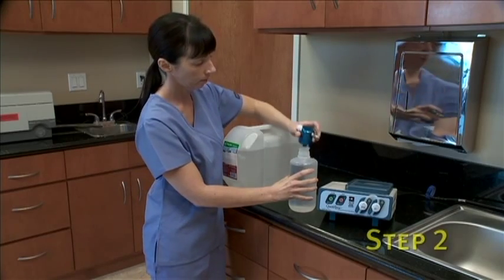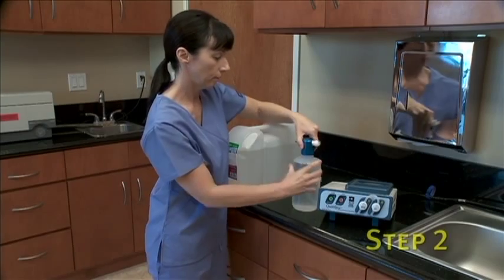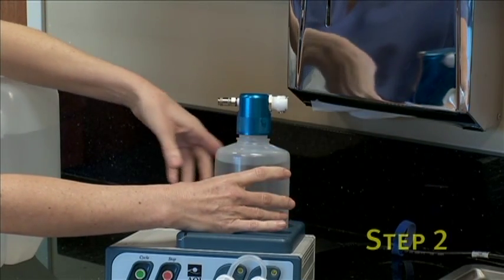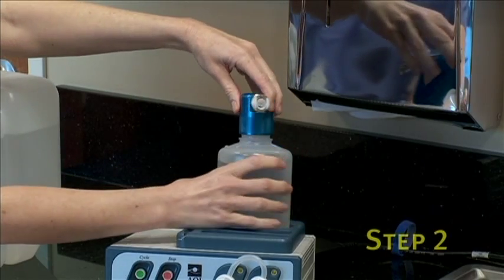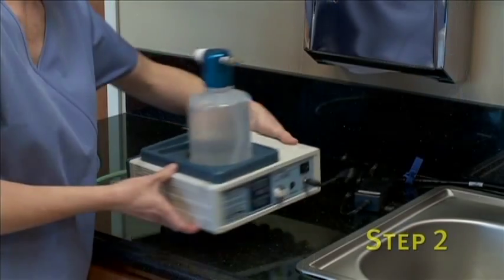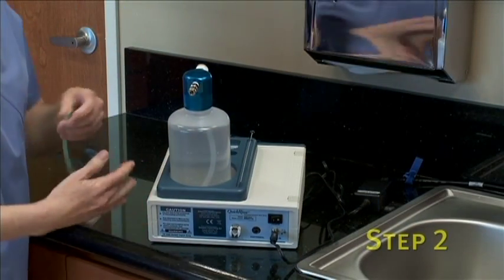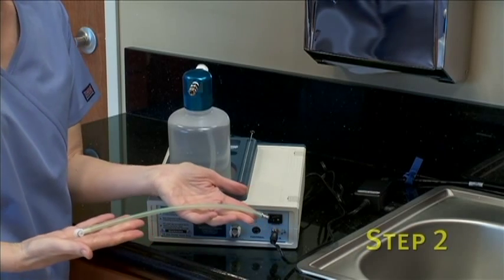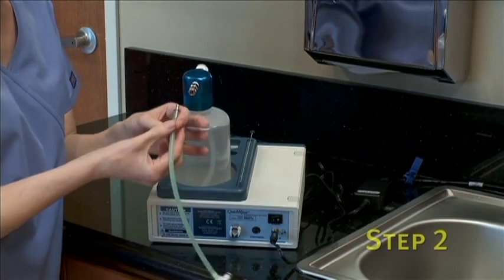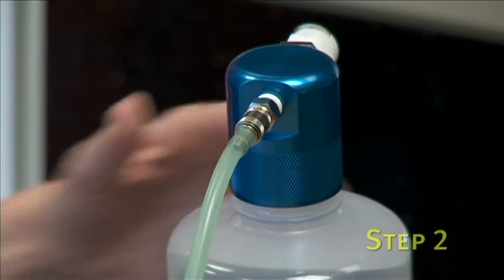Now screw on the fluid container cap and place the container into the well location on the top panel of the unit. Make sure to position the container so that the metal quick disconnect fitting faces to the rear of the unit. Next, take the green air supply tubing provided with your unit and connect it to the metal female connector on the fluid container cap. Make sure you hear a click to ensure the connection is secure.